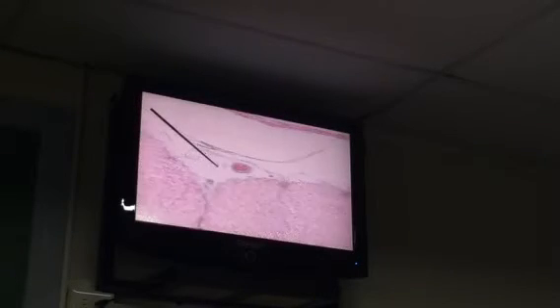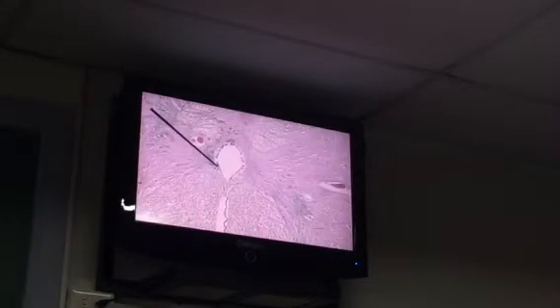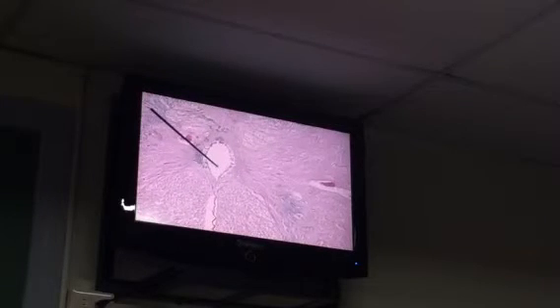If you examine the picture of your spinal cord, you can see that it's a butterfly-shaped structure. There you go, butterfly shape. What I'd like you to take note of is that exactly at the center, you have an opening. We call that the central canal. This is, of course, for the passage of your cerebrospinal fluid.